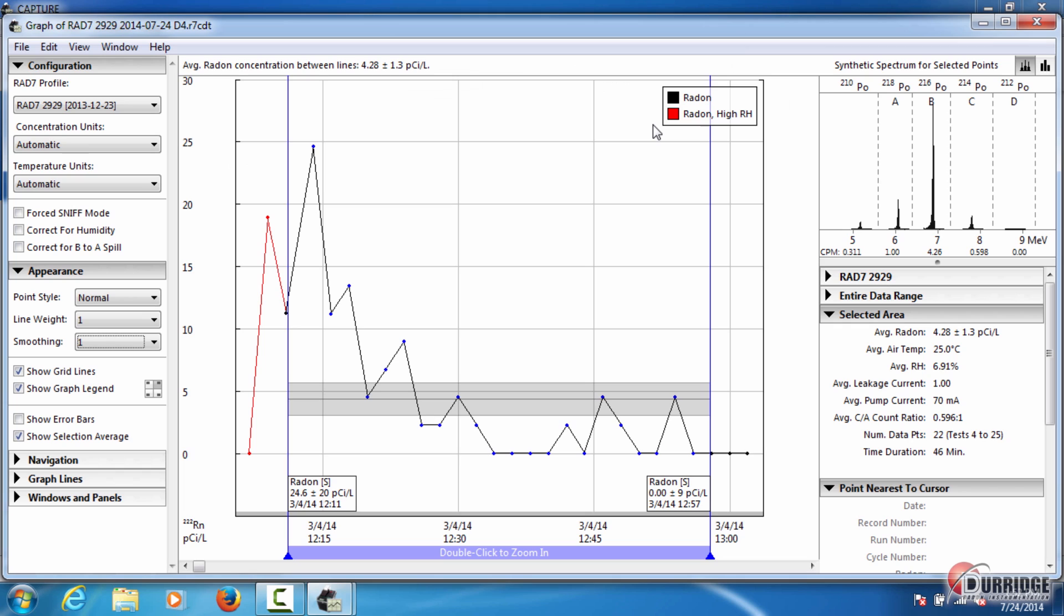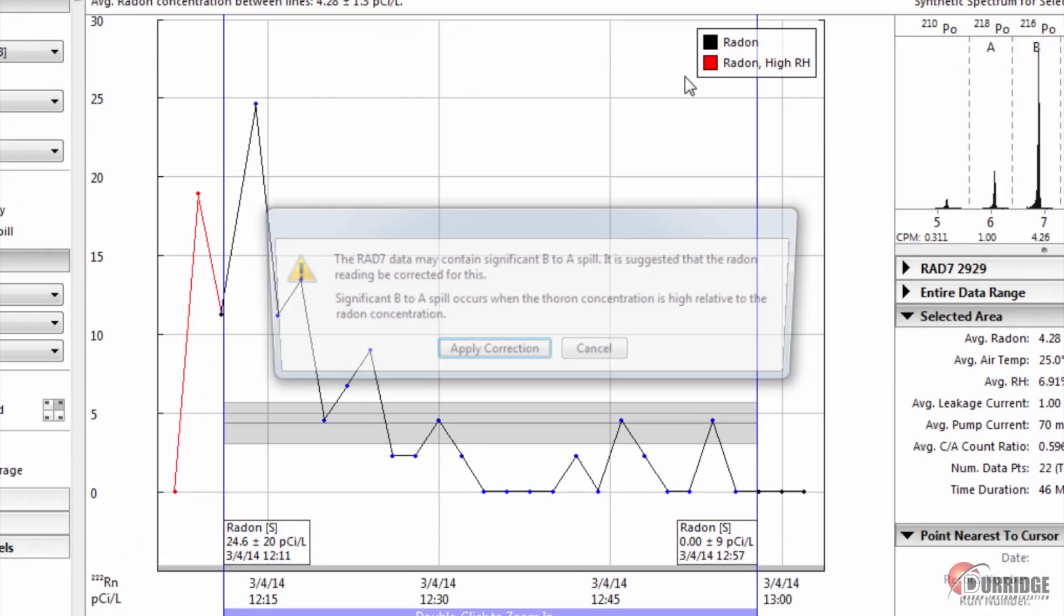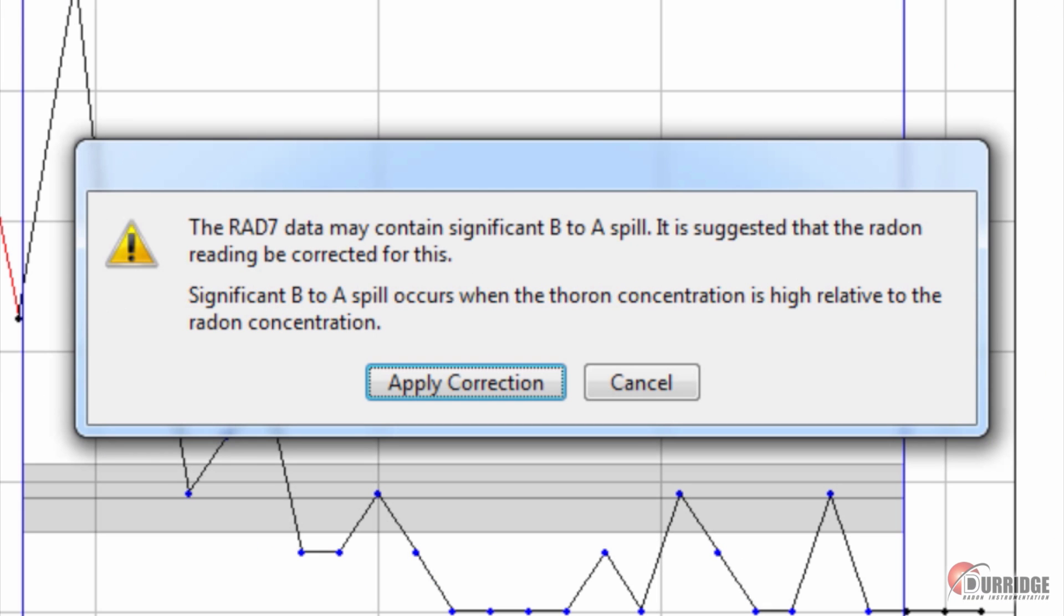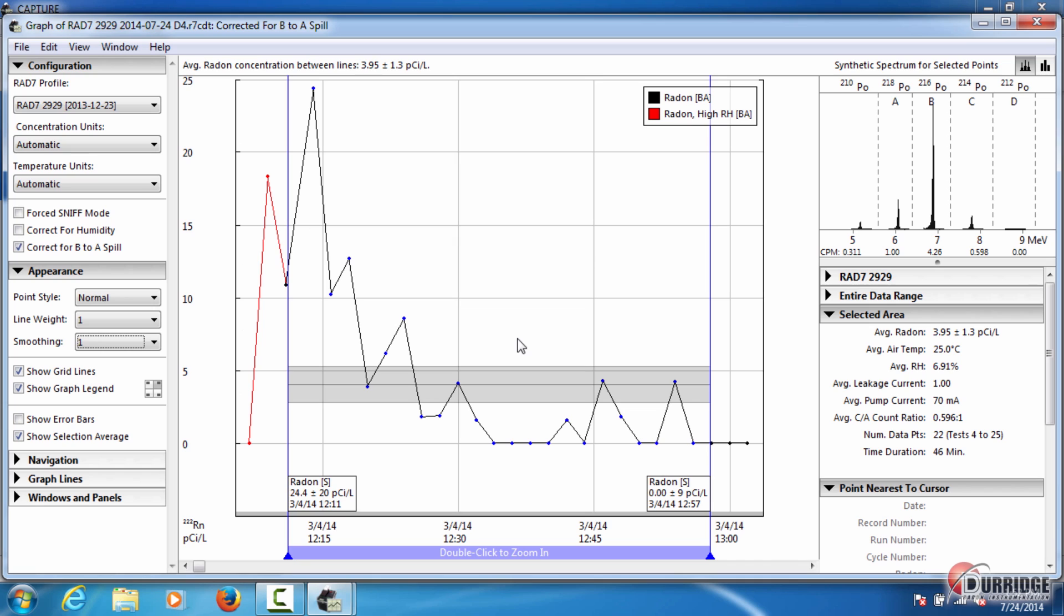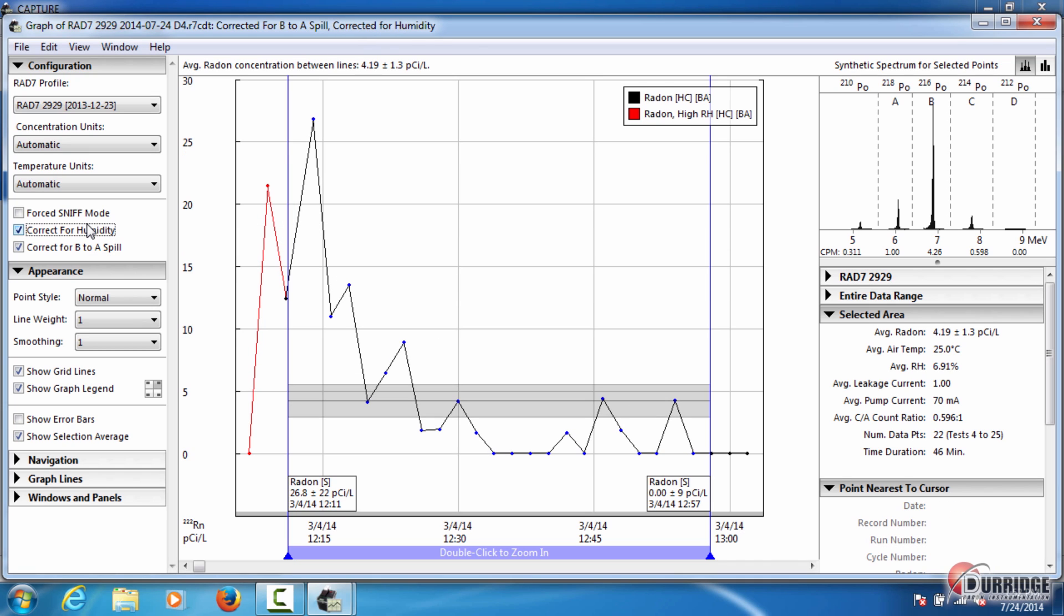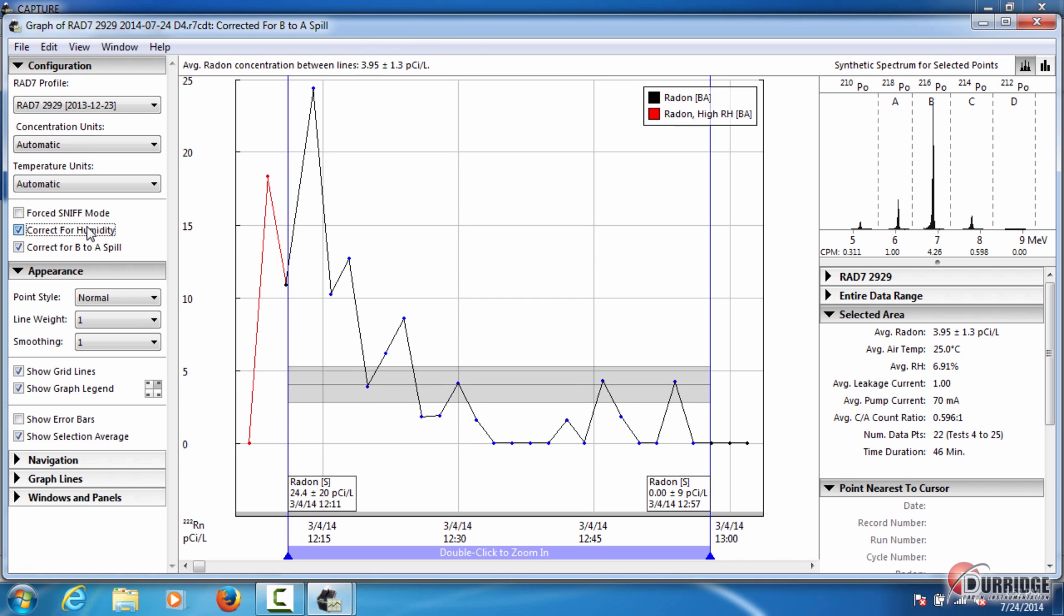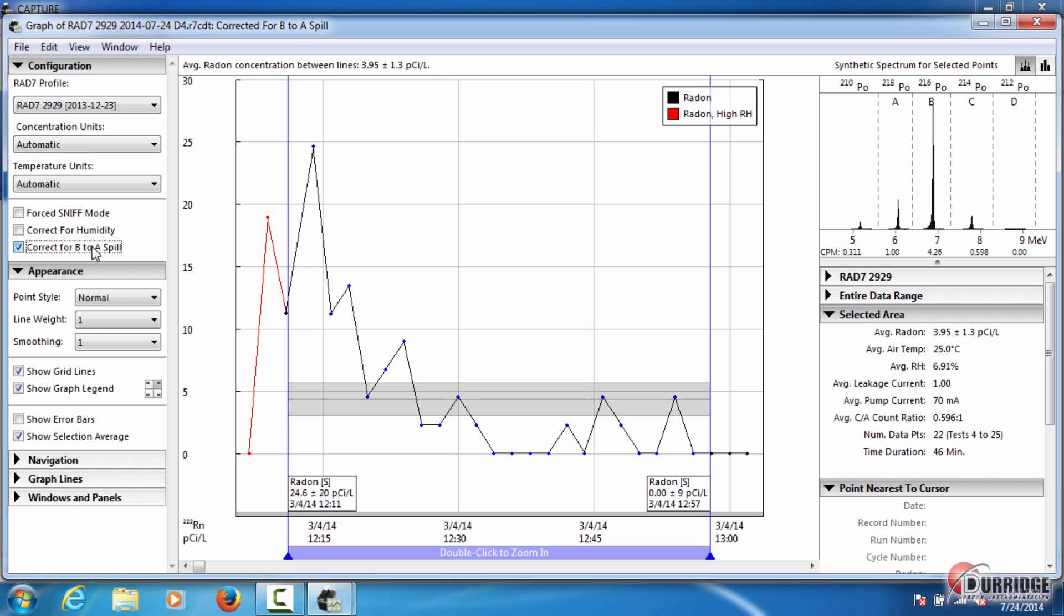After you download the test data to your computer, Capture displays it in the graph window here. As the program loads the data into the graph, it automatically checks to see if it needs to be corrected for humidity levels or for B to A window spill, and a dialog box will prompt you to make any necessary changes. You can change these settings manually at any time by checking the boxes here in the configuration side panel.